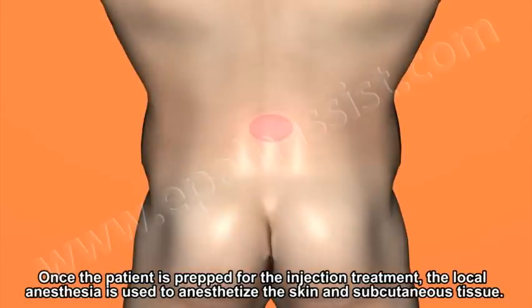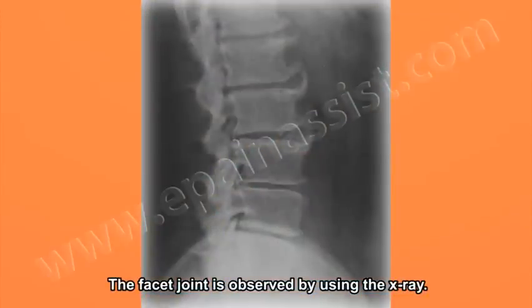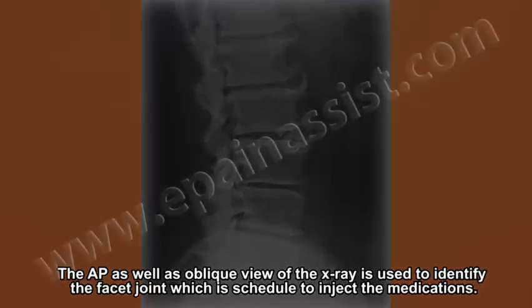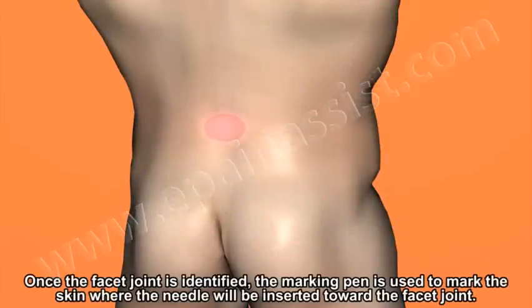Once the patient is prepped for the injection treatment, local anesthesia is used to anesthetize the skin and subcutaneous tissue. The facet joint is observed by using the X-ray. The AP, or anterior posterior view of the X-ray, as well as the oblique view of the X-ray, is used to identify the facet joint which is scheduled to be injected with the medications. Once the facet joint is identified, a marking pen is used to mark the skin where the needle will be inserted towards the facet joint.